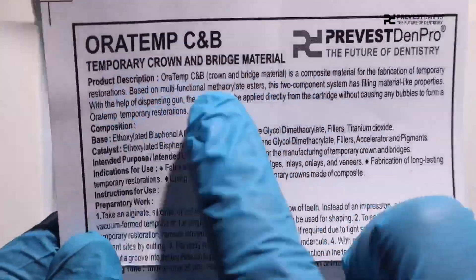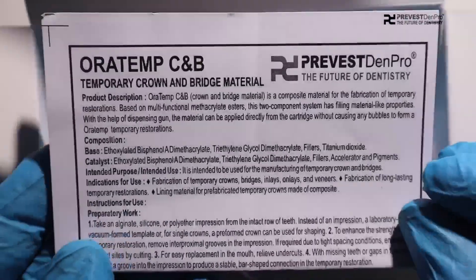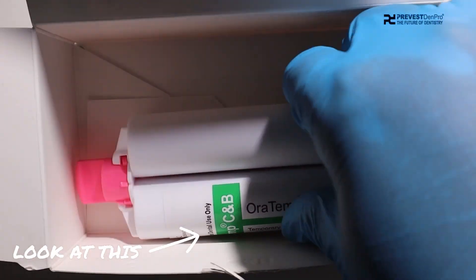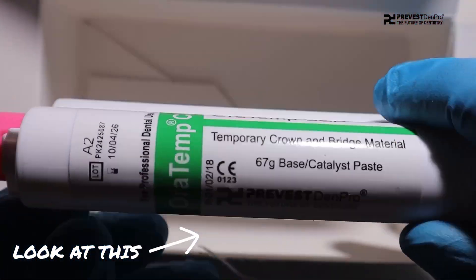First, we have the instructions manual, which should be read very carefully before using the product. Apart from this, we get 16 applicator tips and a cartridge containing the Oratemp C&B material.